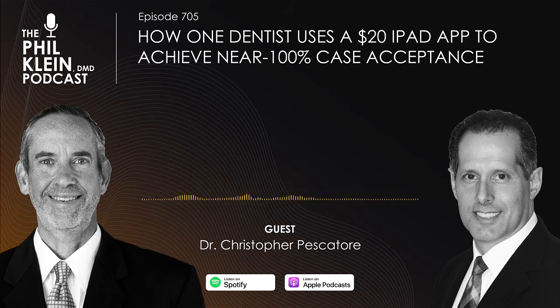Like I had a patient just last week fly in from out of town and I scanned her. But what happens if something happens to that scan, on the small percentage it might? What happens if it gets corrupted? Am I going to fly her back and take off the temps? No, I have an impression. And impressions are still very viable in today's profession. They just are. People don't want to admit it because they want you to buy a scanner, but they are.